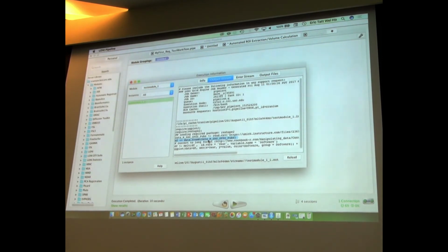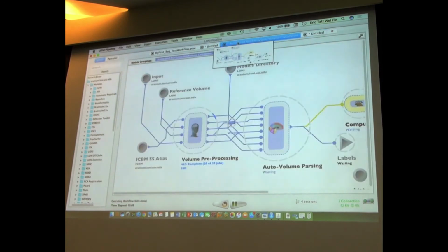So, my own file, I had to send to the server, read it there, send it back to me, and I see it right here in the output shell. A little silly, I agree. But it kind of shows you the notion of, first of all, multiple server communication, right? Porting data to the server, retrieving the results, albeit silly results, and the execution of more. Nobody cares about that, but the rest of these modules are defined exactly the same way.